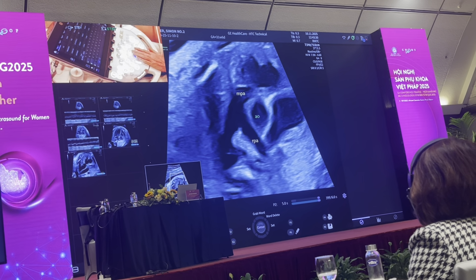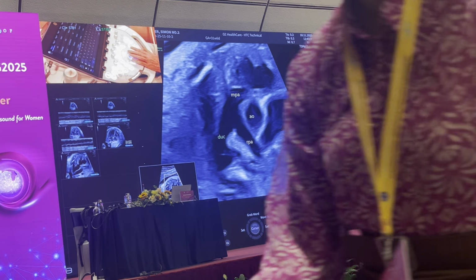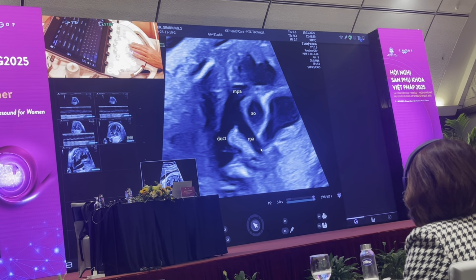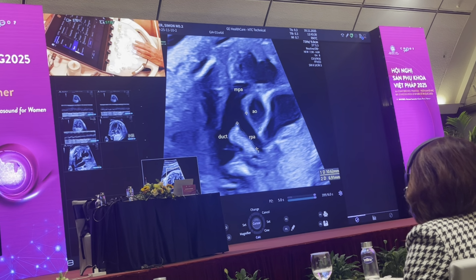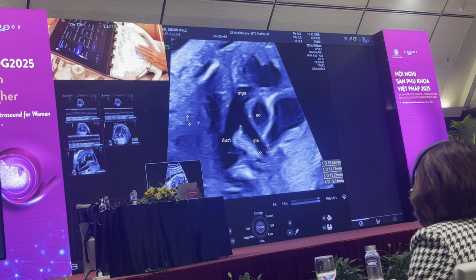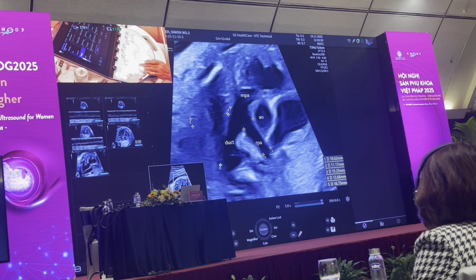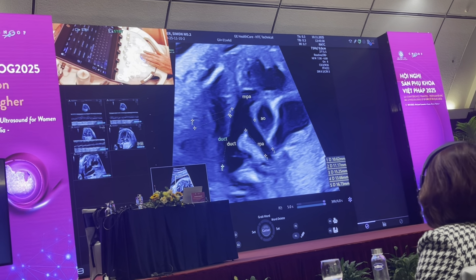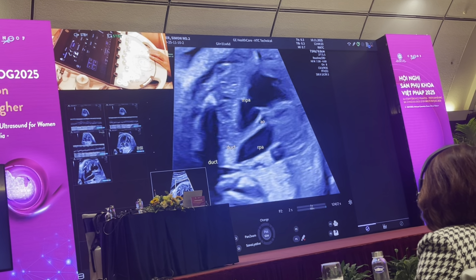Remember, the right pulmonary artery should always be smaller than the aorta, and this is the arterial duct immediately here. So once the pulmonary artery gives off the left and right branch, this is the right branch coming in here, and then I do not show it to you here, but your left pulmonary artery comes in here, and then this vessel from here to here is your arterial duct. So the arterial duct is quite a long vessel, and it's important to see that you see flow in the arterial duct. So that's just showing you the normal anatomy of those vessels.